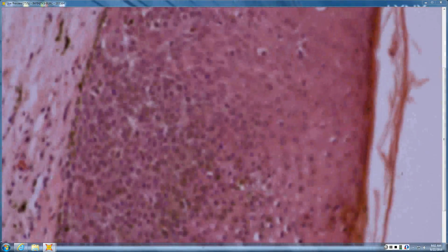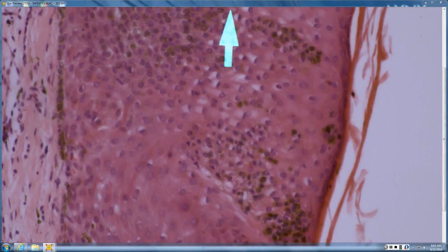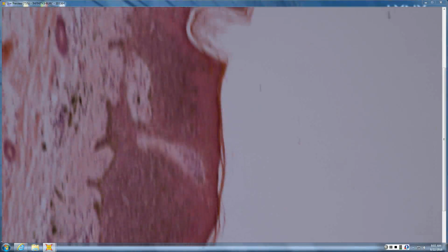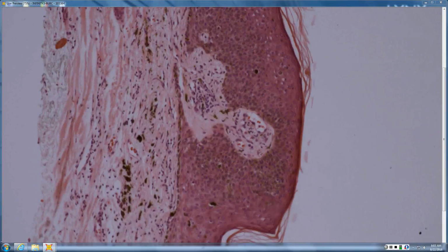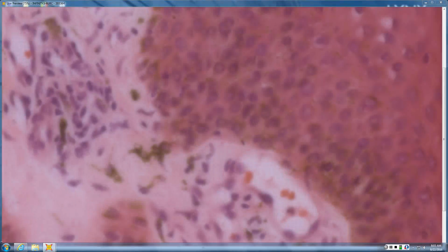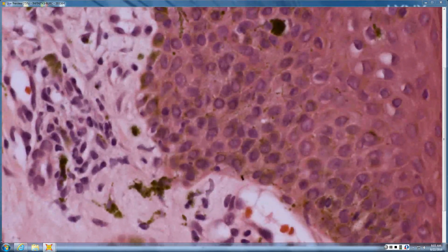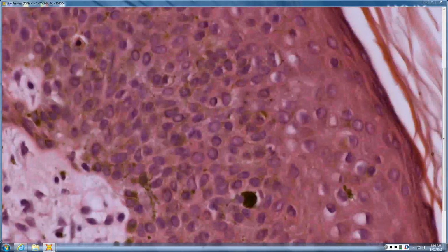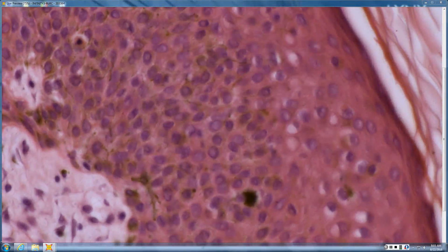And then if you look a little higher, you can see not only is there pigment, but in some areas there are pigmented dendrites visible. So anyone want to chime in? What are we looking at? Melanoacanthoma, where you have dendritic melanocytes as part of the tumor. So you can have pigmented poromas. They're actually quite common, especially in darker-skinned races. You see pigmented poromas. But you remember the pigmented seb and melanoacanthoma are in your differential. And there are some of the really nice pigmented melanocytes, dendrites in the tumor.